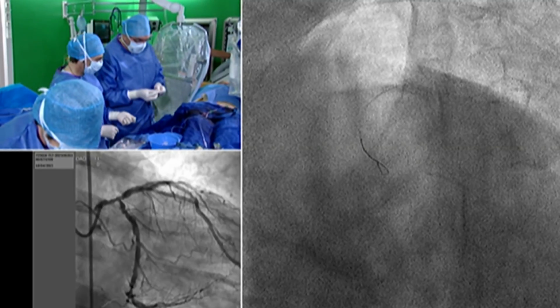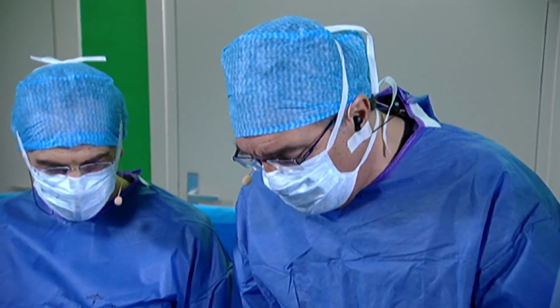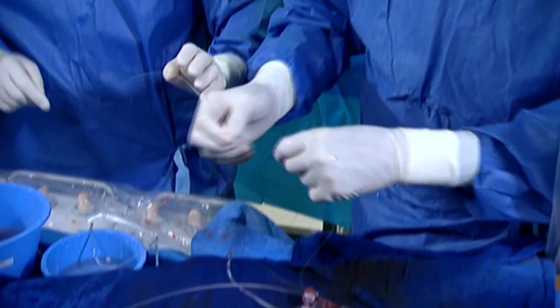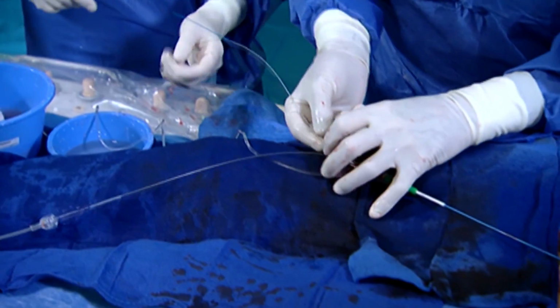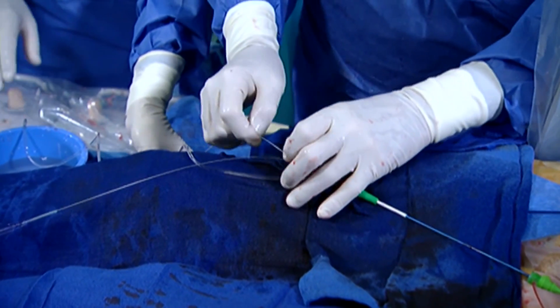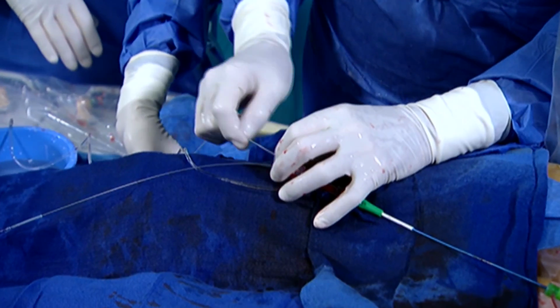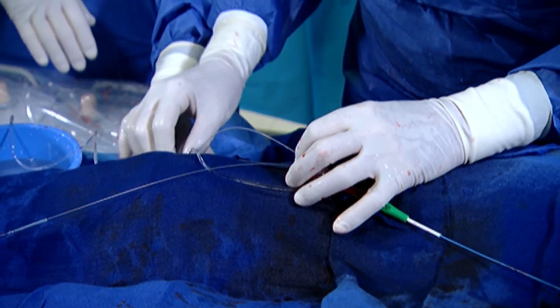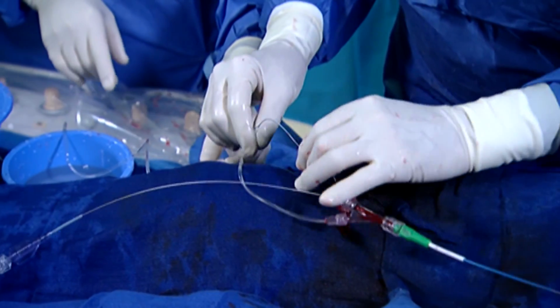So 4.0, we have used this before, so I'm a little bit afraid of the possibility to use this in the 6 French guiding. We will try, I'll reshape the balloon a little bit. If not, I will take a new one. It's quite difficult.